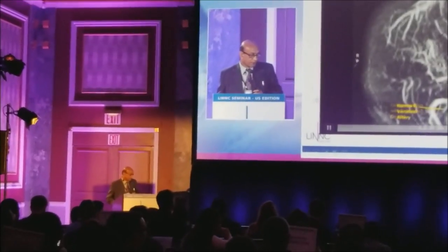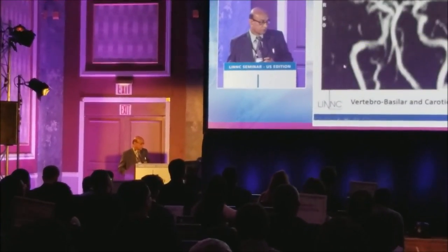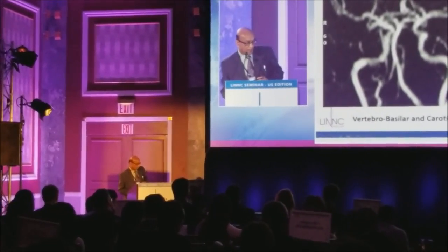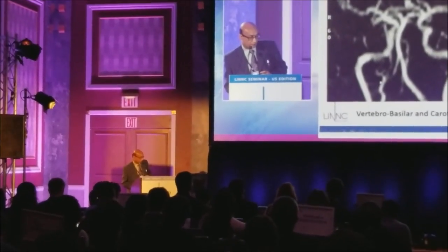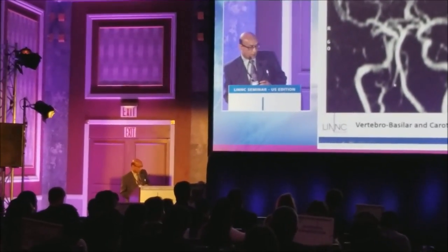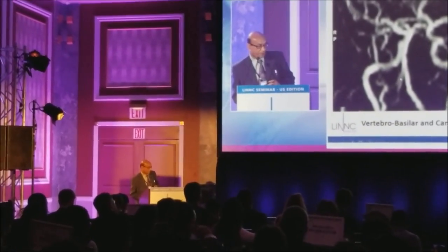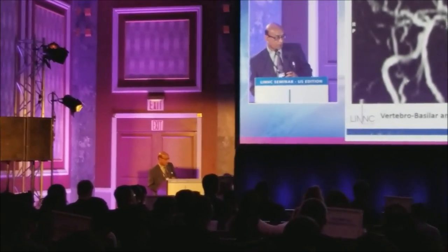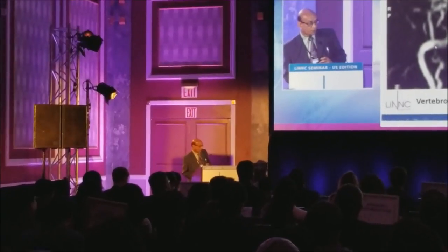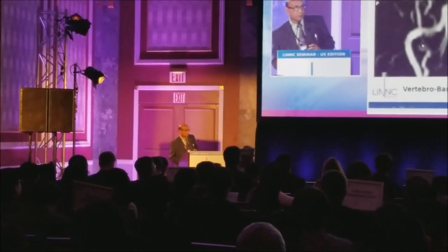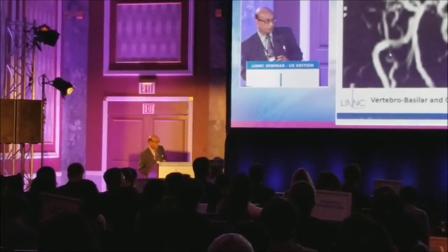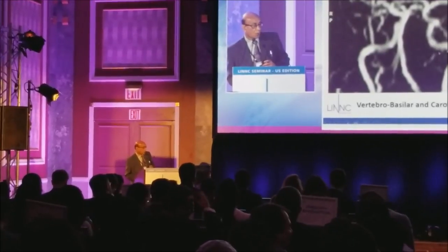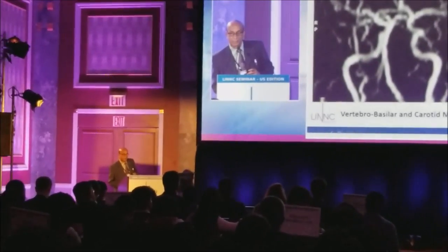So now let's come to the 3-dimensional time of flight screenshots. Now take a good look. This is the accessory right vertebral artery. This is the narrow right vertebral artery. And as you can see, this is a bifid narrow right vertebral artery. An accessory vertebral artery on the right side is having a communication with the bifid narrow right vertebral artery. And it also seems to have a communication with the right internal carotid, as well as an abnormal distribution on the right side of the brain which is not matched by a corresponding distribution on the left side.